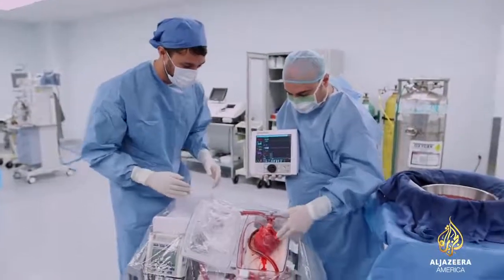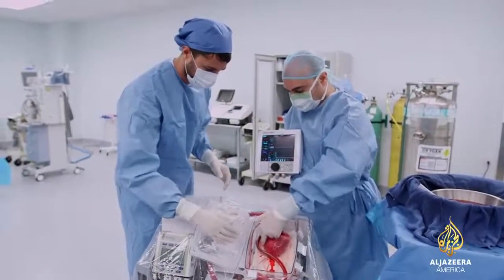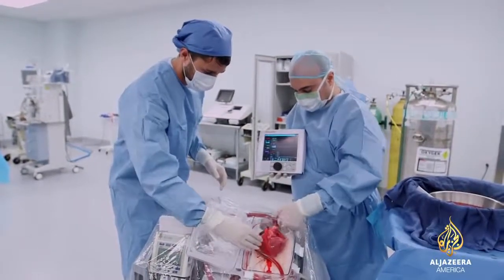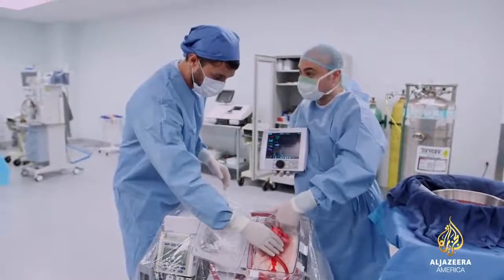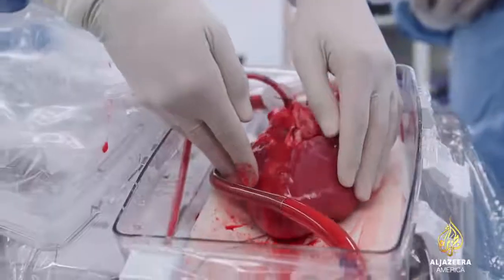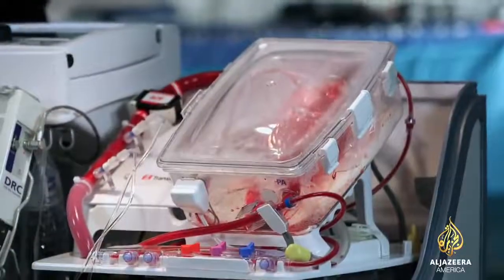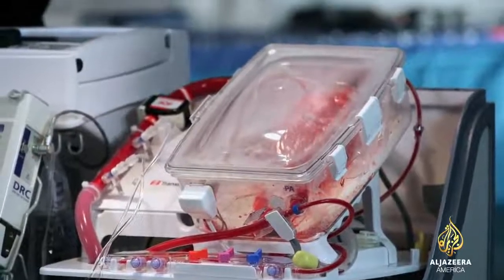This is a training heart today, so by all means, if you want to feel the ventricle pulsating, right side and left side, and you can feel the vessel itself, see the pressure in the vessel. Oh, it's warm. It's warm, it's beating, it's functioning. It's just functioning as if it's in your body. Gosh.